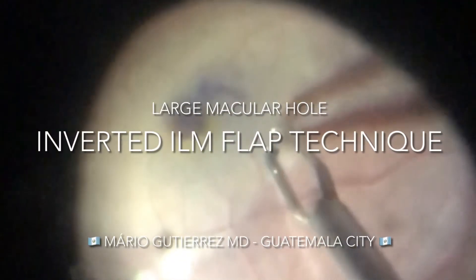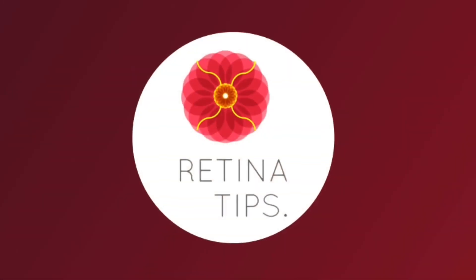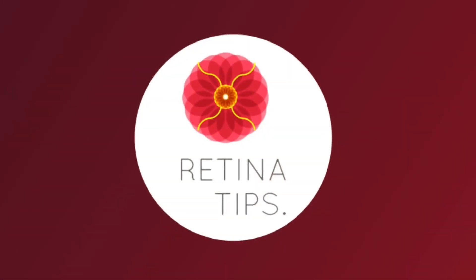This is a video shared by Dr. Mario Gutierrez from Guatemala City, Guatemala. This is a case of a large macular hole in a patient recently treated with scleral buckle for rhegmatogenous retinal detachment.